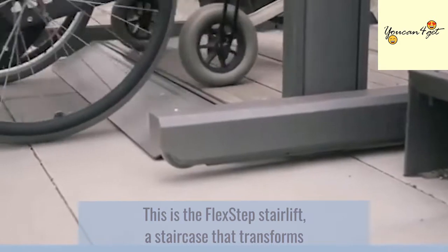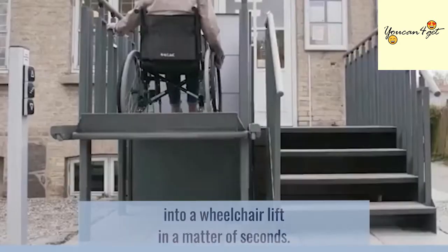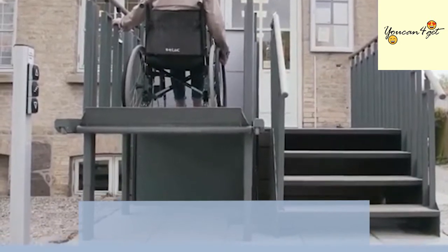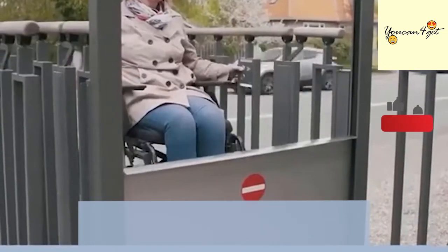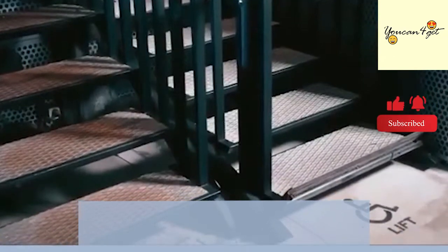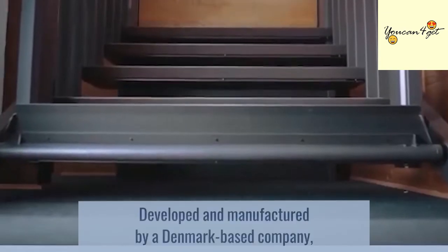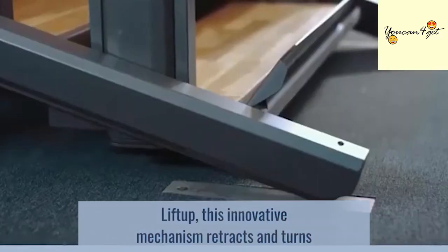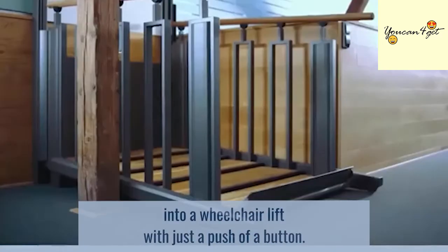This is the FlexStep Stairlift, a staircase that transforms into a wheelchair lift in a matter of seconds. Developed and manufactured by a Denmark-based company, LiftUp, this innovative mechanism retracts and turns into a wheelchair lift with just a push of a button.